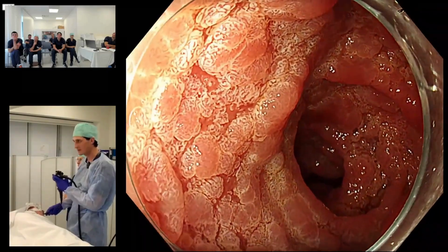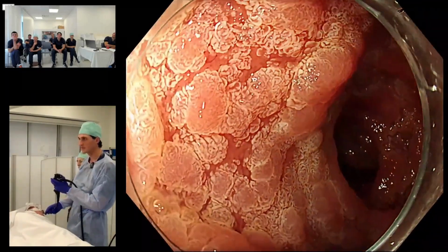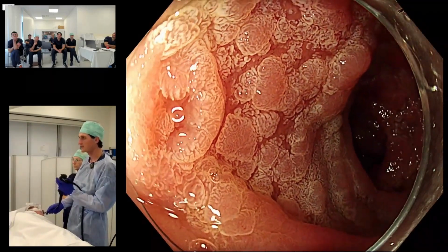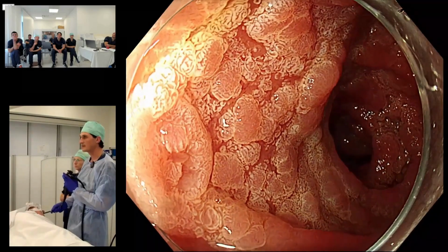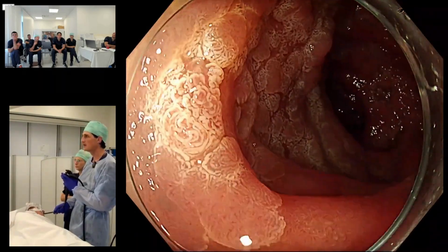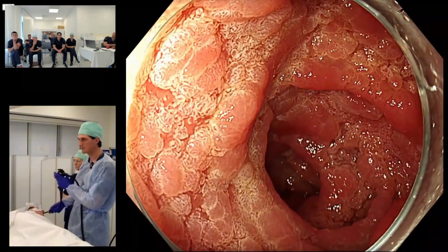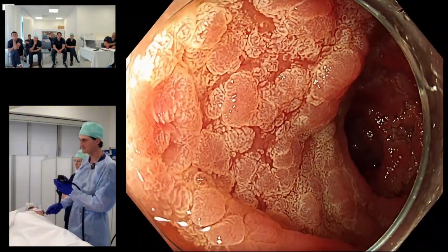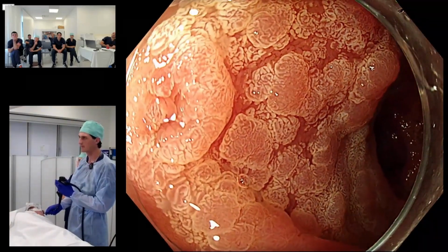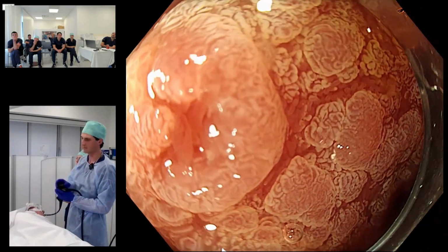We have it here at our 6 o'clock. The papilla, the major papilla, which it is involving. It's actually starting from the papilla and just above that. At the 9 o'clock. And so if you can rotate so that the major papilla is in the 10, that would be the sort of neutral position.